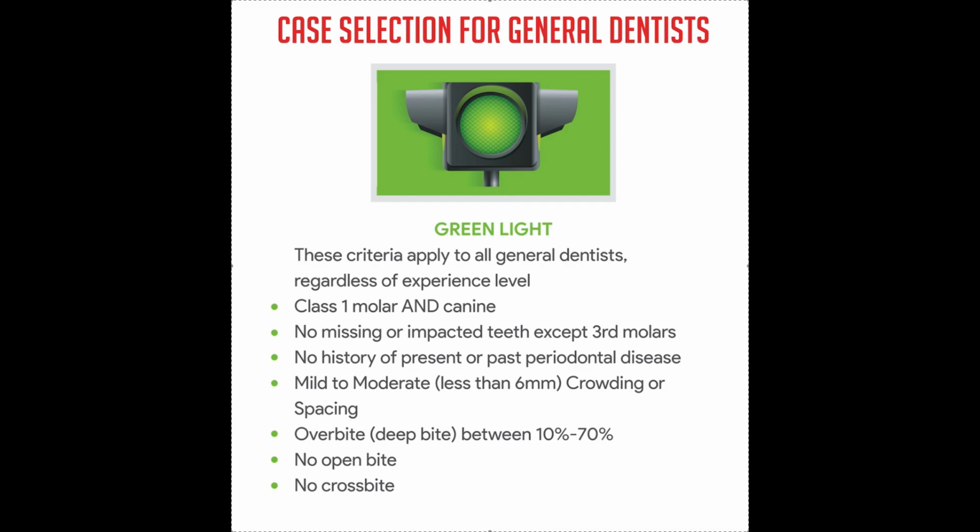We're going to do a three-part series on case selection for general dentists. This is my recommendation, what cases to take, what cases to not take, depending on your experience level. We're going to start first with the green light cases. Green light cases means these are cases that any general dentist or pediatric dentist can take and should take. This is where I want you to get started.